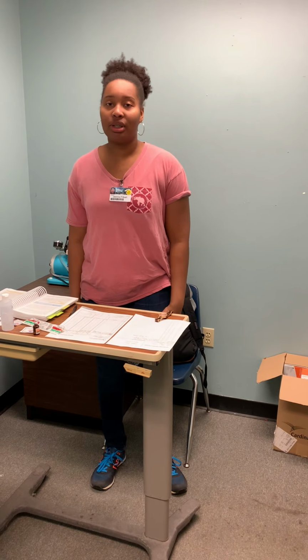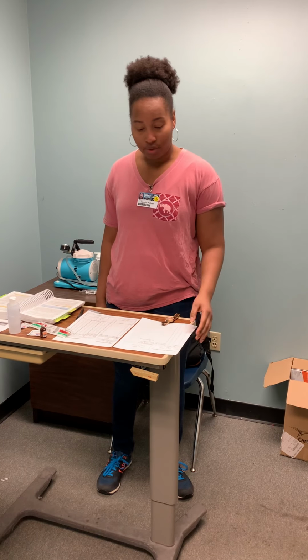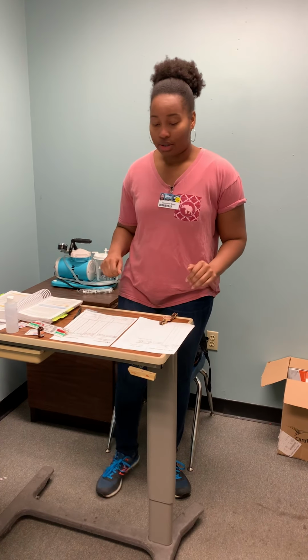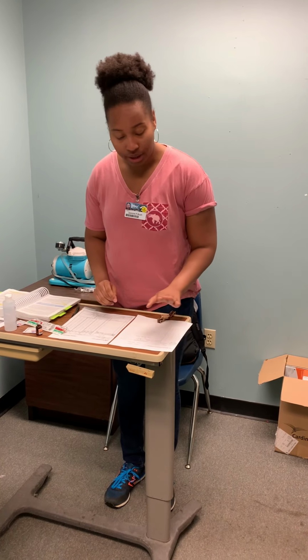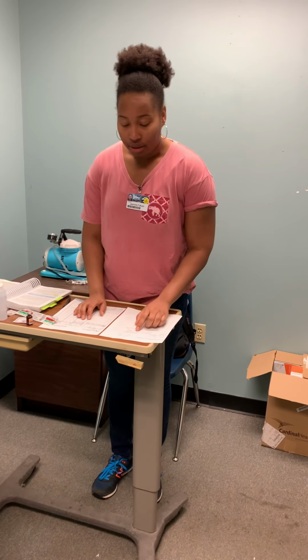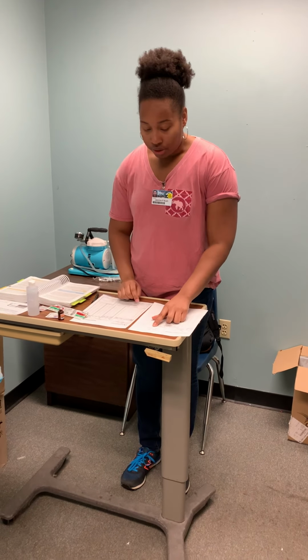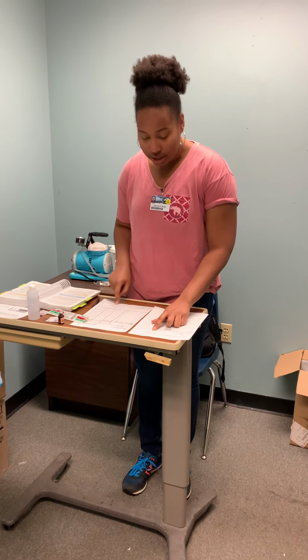My name is Jasmine Bush, and I'll be providing today's IV push simulation with furosemide. First, I'll start by verifying my doctor's order with my MAR. I'll be checking the patient's name and date of birth: Janet Green, birthday June 3rd, 1972.